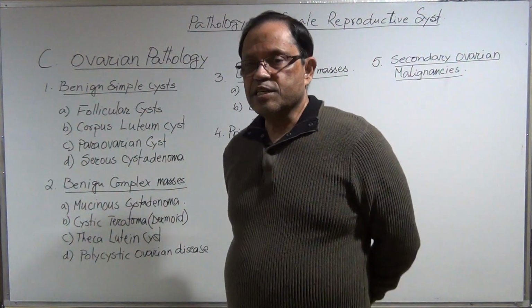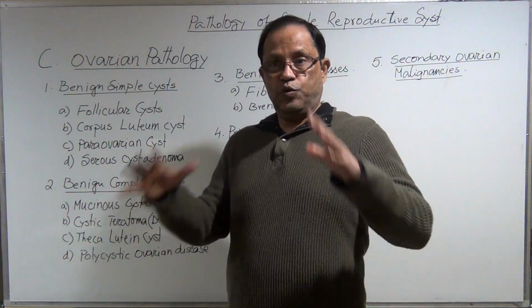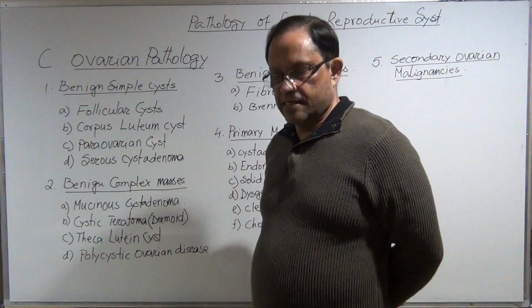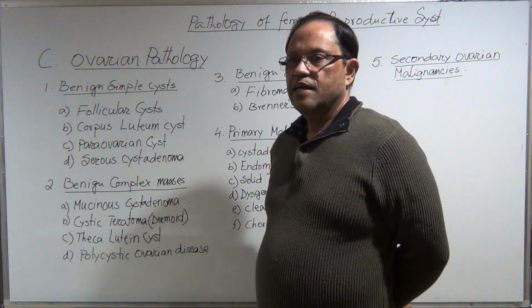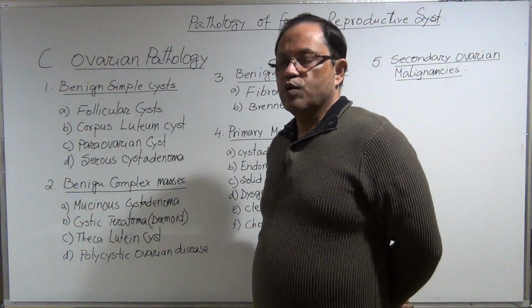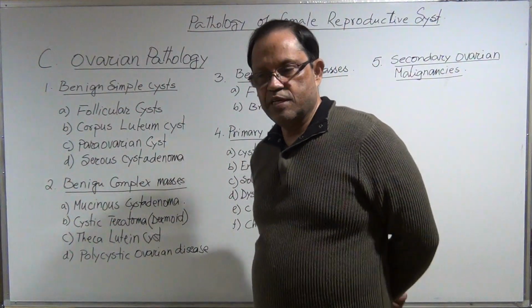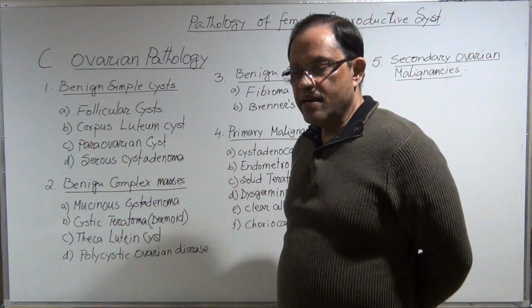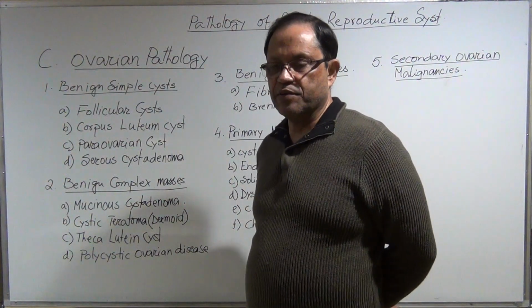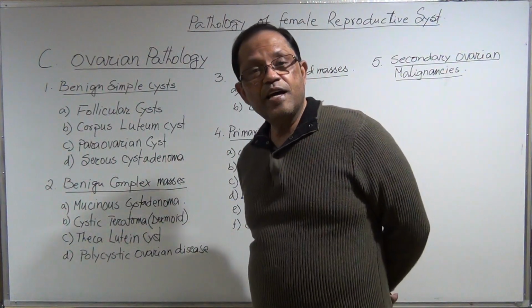And then ovulation takes place. So when the Graafian follicle is seen in full size, it looks like a cyst. Yes, it is a cyst. Do I need to measure? Yes, we need to measure. What is the size? 2 centimeters. Take the LMP history and we declare, okay, it is a Graafian follicle, or mature follicle, adult follicle, that is going to be ovulated.